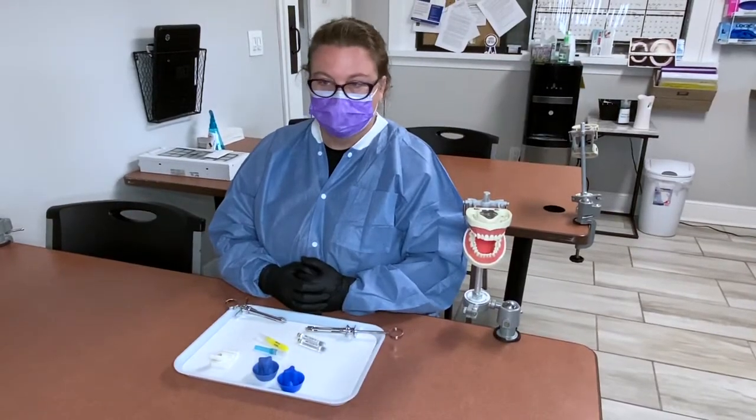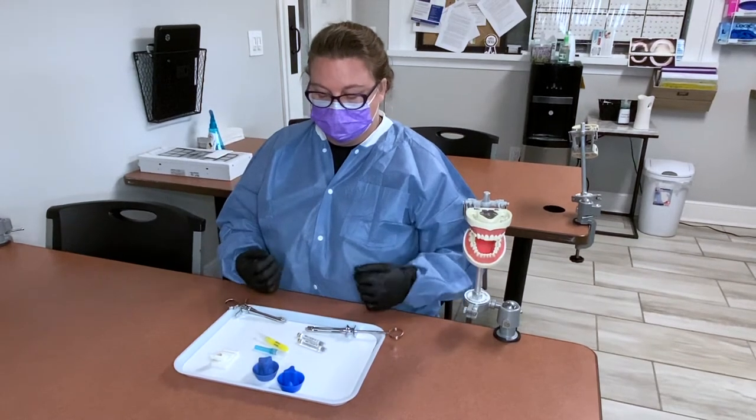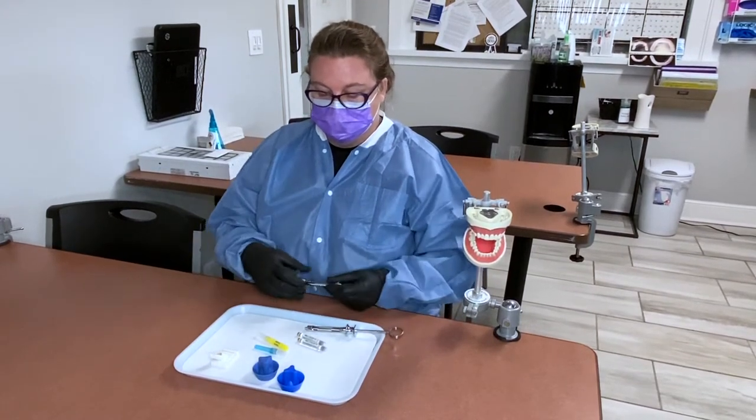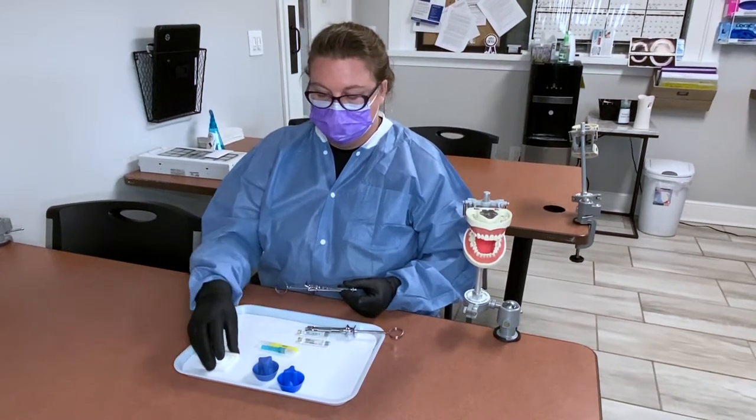Today we are going to show you how to assemble and disassemble your anesthetic. We have our syringes, our carpules, our different needles, and also our needle cappers. Teresa is going to demonstrate and walk you guys through it.